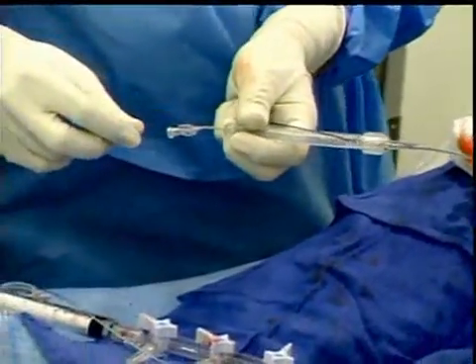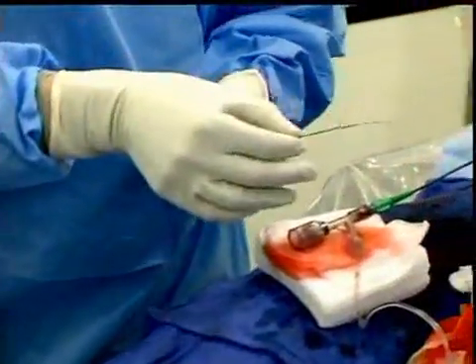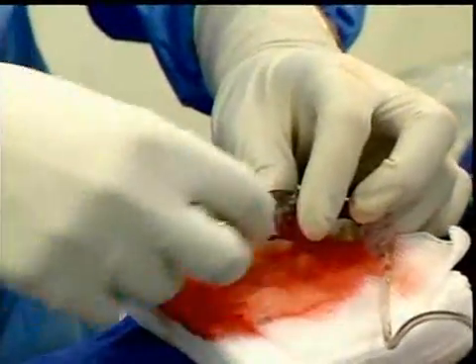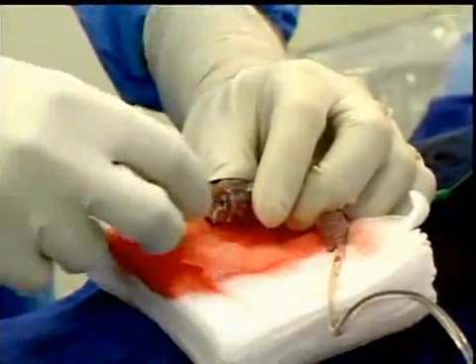So we have that ready, and I have a feeder with a little curve, and that's how we are going to use to get in. Looks extremely easy to use. I remember having used the pilot wire several years ago, which was the same concept, but not half as simple to use.